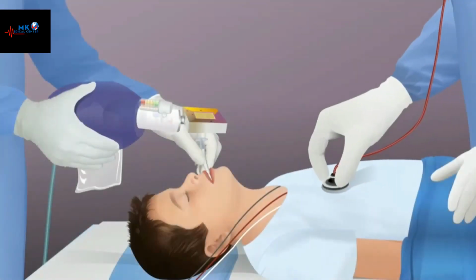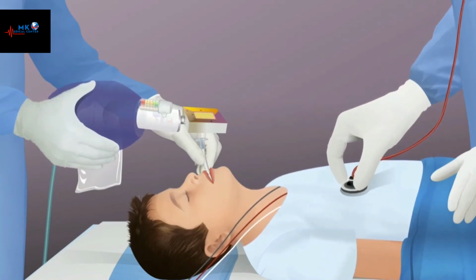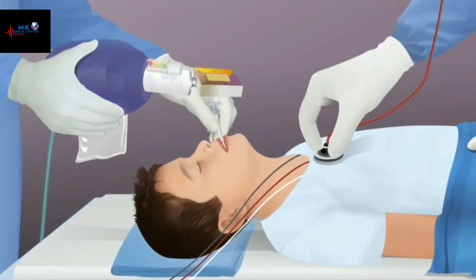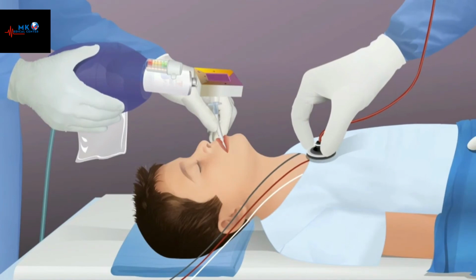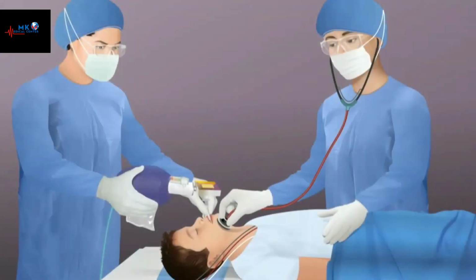Once the ET tube is placed, attach the bag and assess the lung fields for air movement, symmetric breath sounds, and adventitious sounds. Assess for correct ET tube placement via stethoscope and capnometer. Assess for an air leak around the ET tube as indicated by the practitioner to verify appropriate ET tube size.